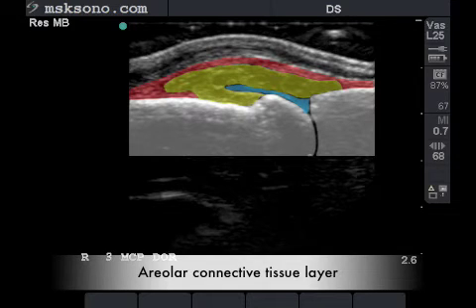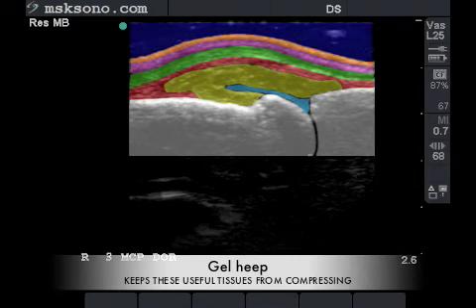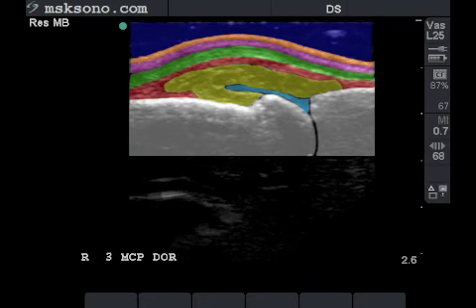Highlighted in red is the areolar connective tissue layer, followed by the common extensor tendon, which appears distended due to the thickened structures beneath it. In purple is the subcutaneous layer, followed by the orange layer, which is the cutaneous layer, and also the very important gel heap, keeping these structures from being compressed.